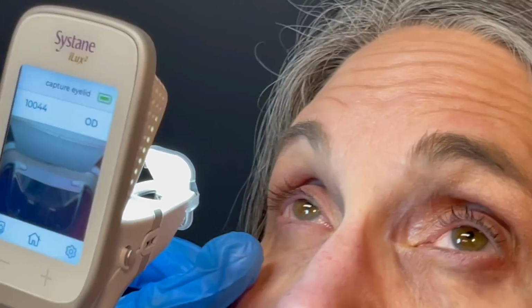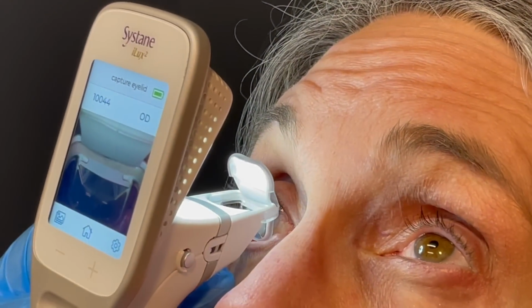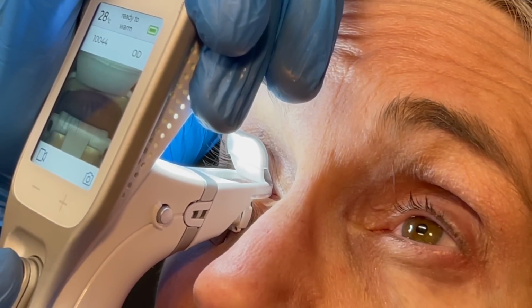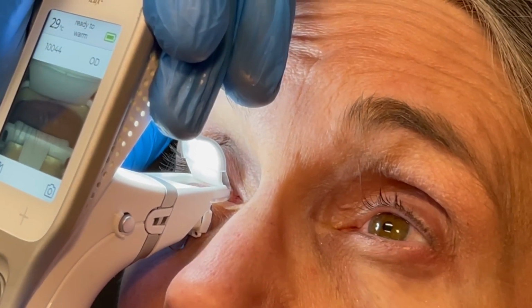You ready? Ready. Okay. Lean your head back for us. Look up to the ceiling as high as you can go. And we just slip this into the lower eyelid right there. We line that up. Grab the lid, and you can go ahead and close your eyes for me, Mom.